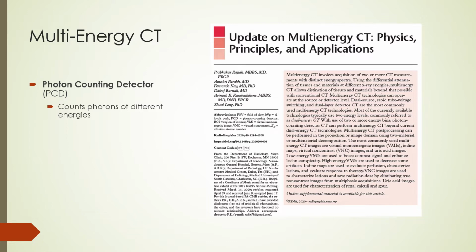The use of different approaches like dual sources, kV switching, dual layer detectors, and photon counting detectors enables the reconstruction of CT images at different energies. This is called multi-energy CT.